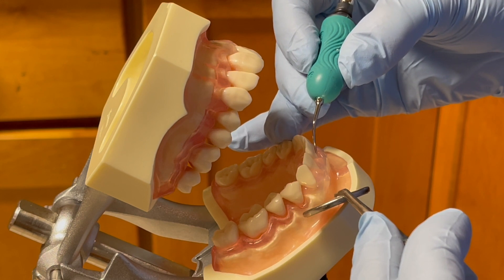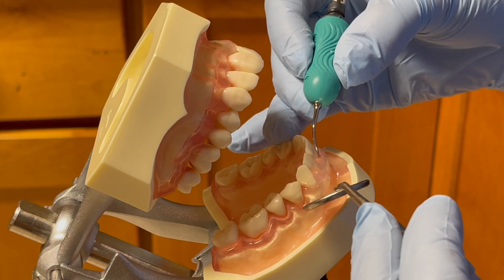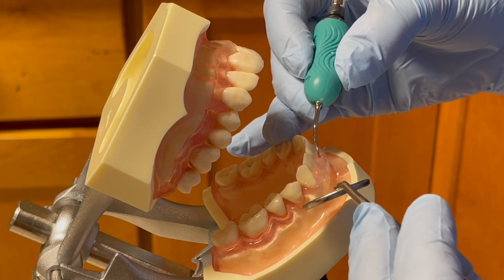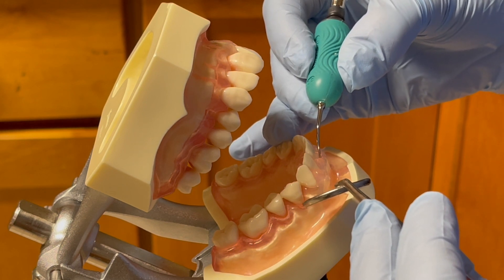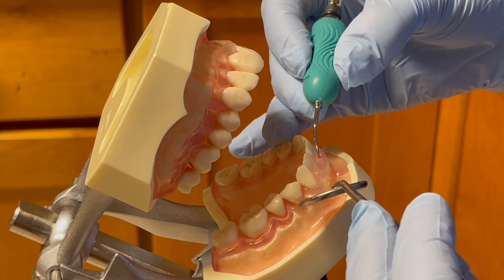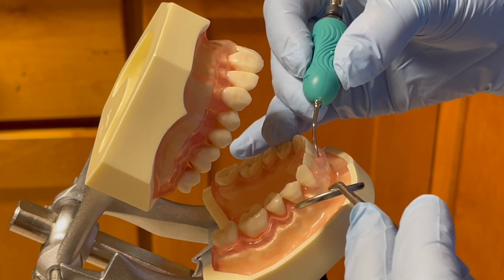Then I insert the tip at the midline with vertical orientation, adapting the 2 to 3 millimeters of the lateral surface of the working tip to the tooth surface, maintaining at a 15-degree angle.